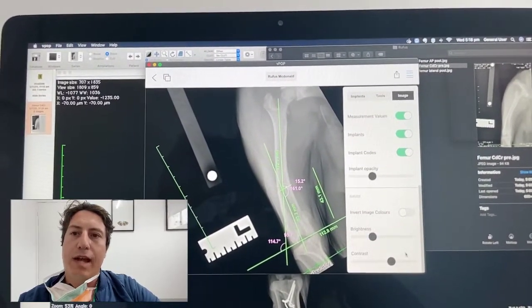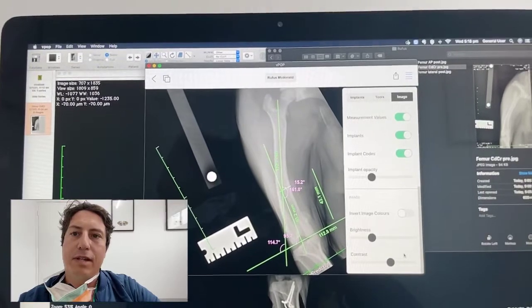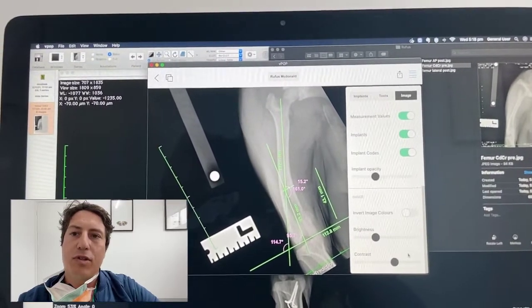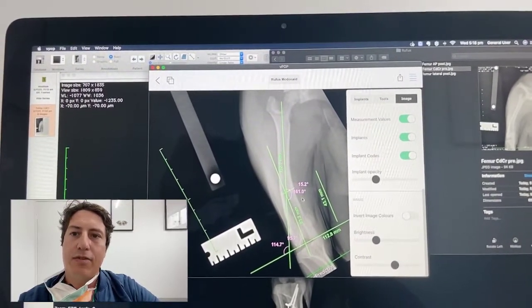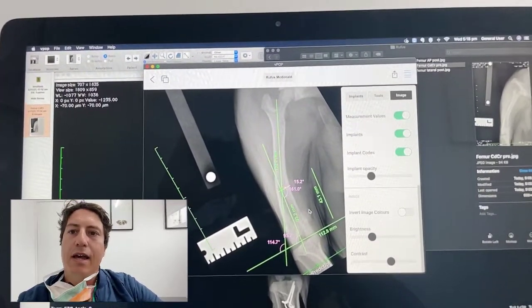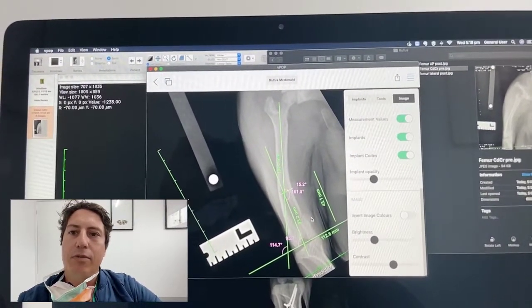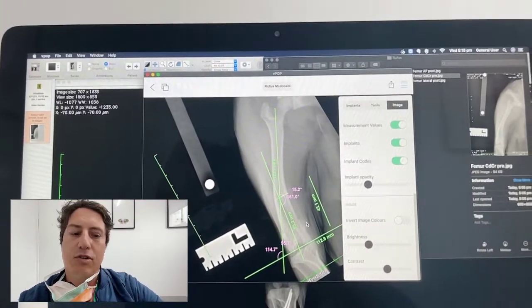What we did was effectively a distal femoral osteotomy for femoral varus — we can see that on this x-ray here — and then we also did a tibial crest transposition.